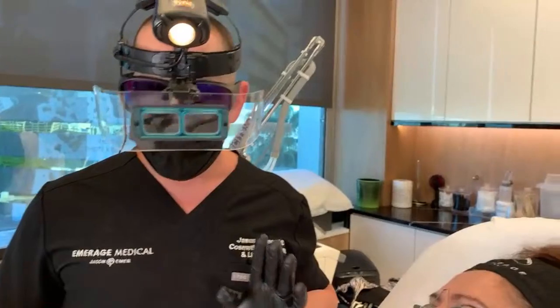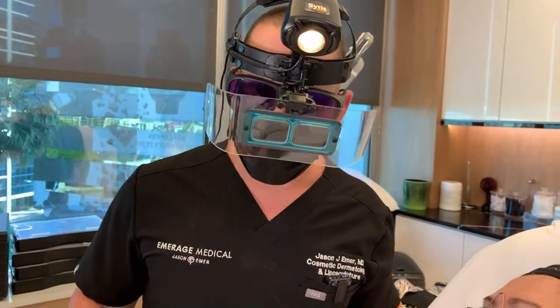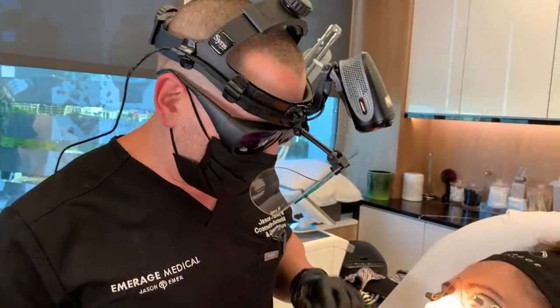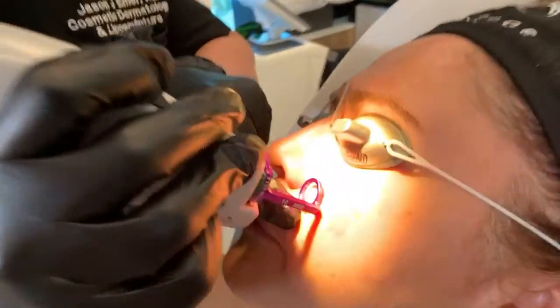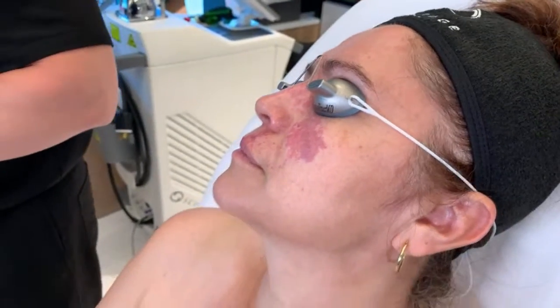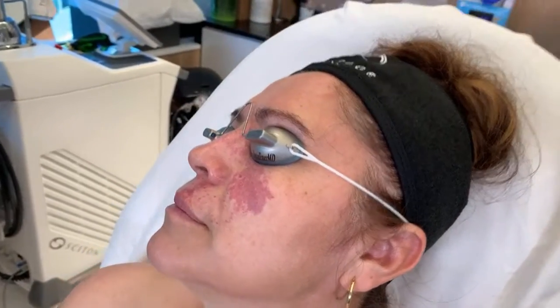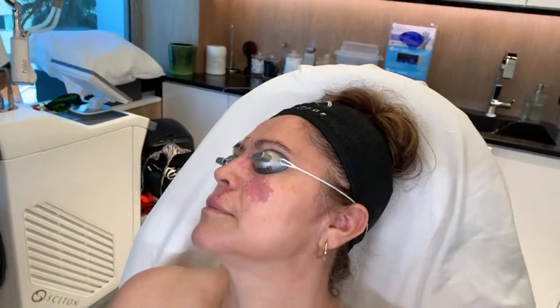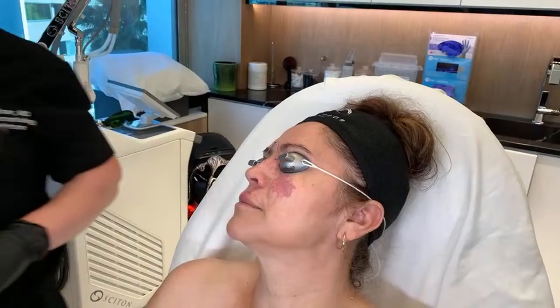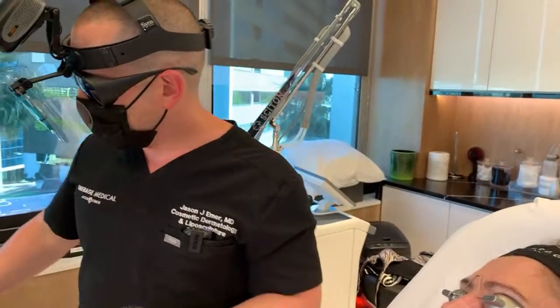We're going to use the V-beam — a 585 to 595 nanometer vascular laser. I'm going to do a pulse so you guys can see, because it's pretty shocking. It's going to turn it — it's usually a bluish purple. The first time we do treatment, we don't want to go too aggressive, because if you cause the birthmark to involute too quickly it actually causes problems.